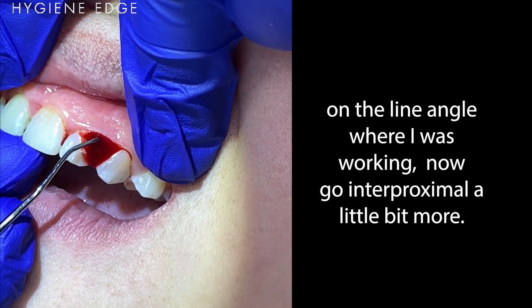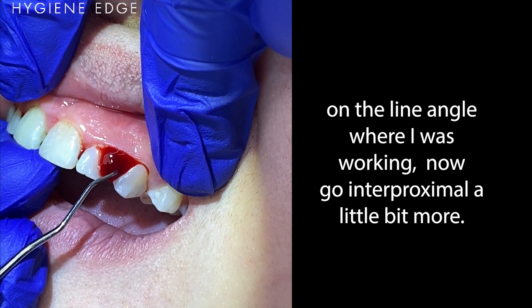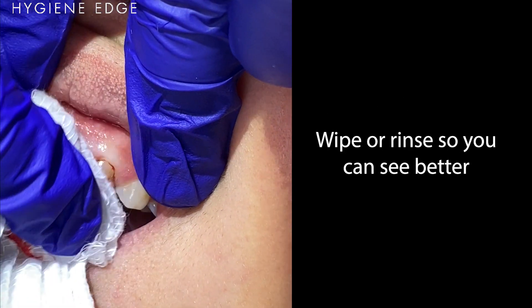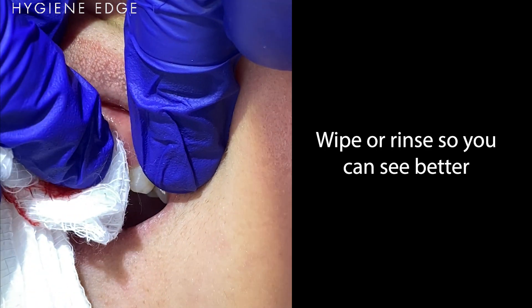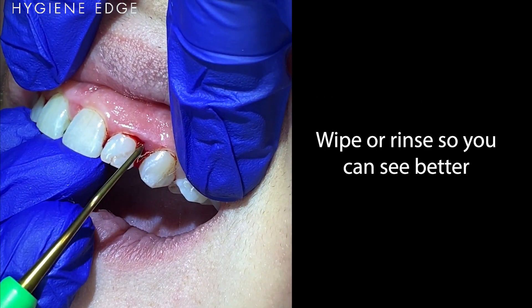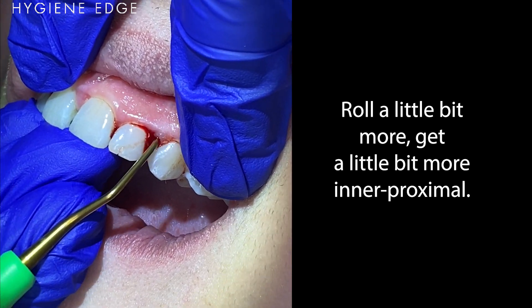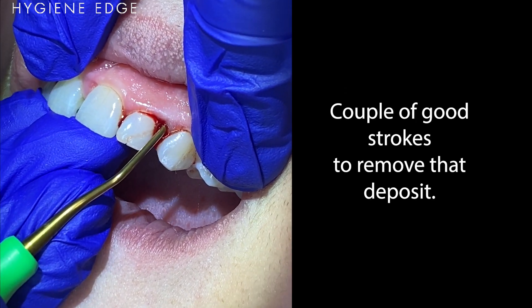That feels good right here on the line angle where I was working. Now interproximately a little bit more — I need to instrument just a bit. I'm gonna roll a little bit more to get a little bit more interproximal. A couple good strokes to remove that deposit.